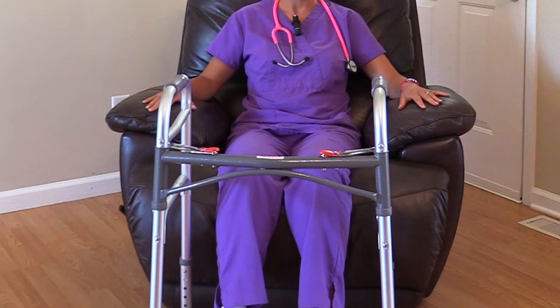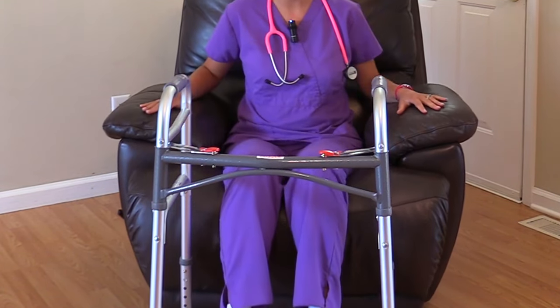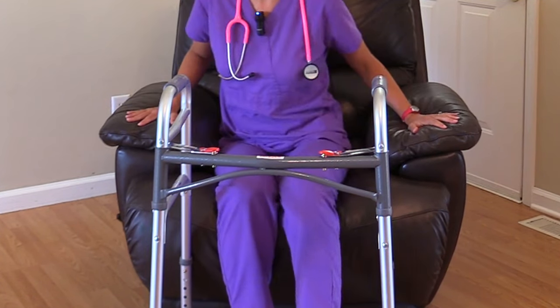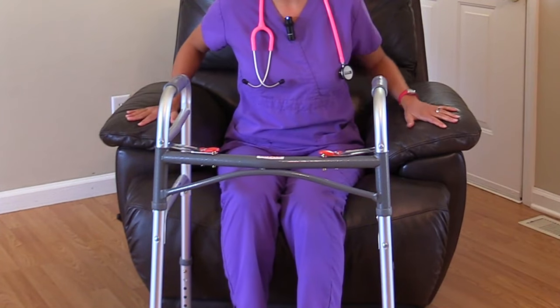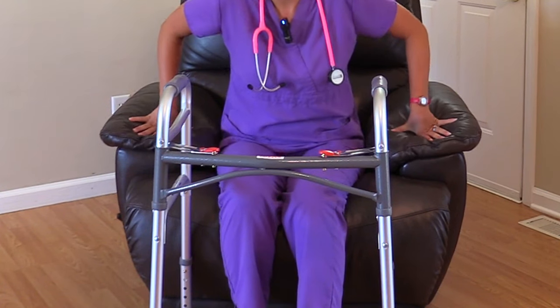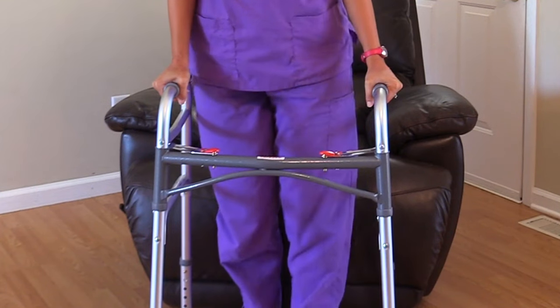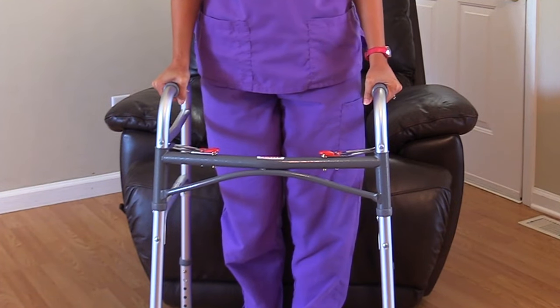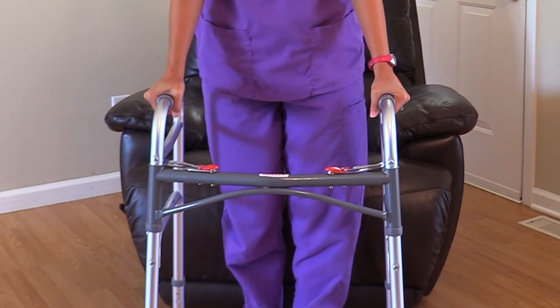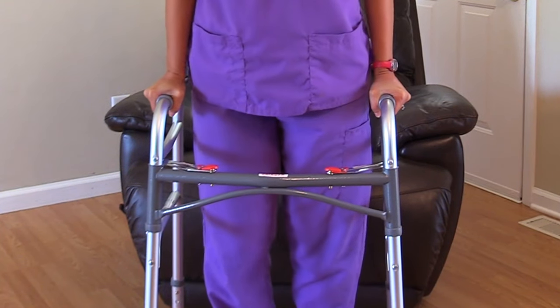To get up from the chair, the patient makes sure the walker is out in front of them. They lean forward out of the chair with their hands on the armrest and slightly extend the weak leg out. Then they put weight on their hands by pushing up on the armrest of the chair with their strong leg, and move their hands onto the hand grips of the walker. Then they are ready to ambulate: lift the walker, make sure all points are on the floor, move the weak leg, put weight on the hand grips, and then move the strong side.